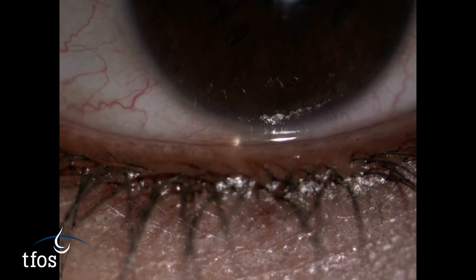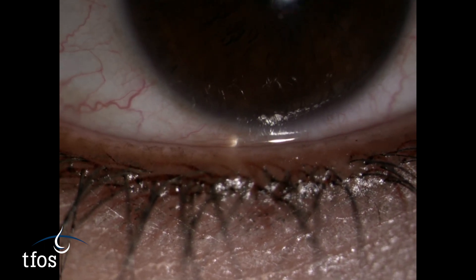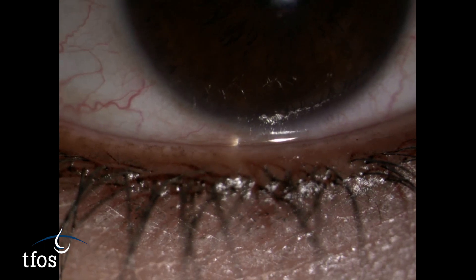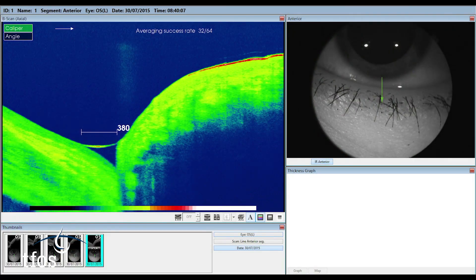Pay attention to the quality of the tear meniscus as well as its height. Optical coherence tomography, or OCT, can be used to get a cross-sectional image through the tear meniscus profile, from which the area can be quantified and the actual volume estimated.